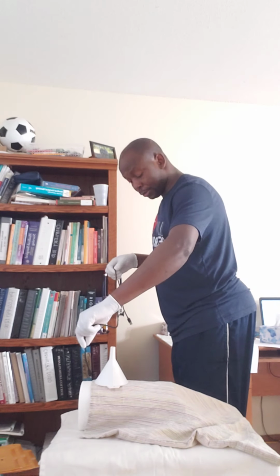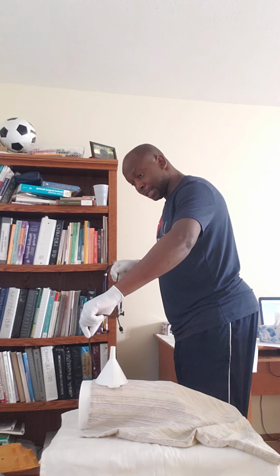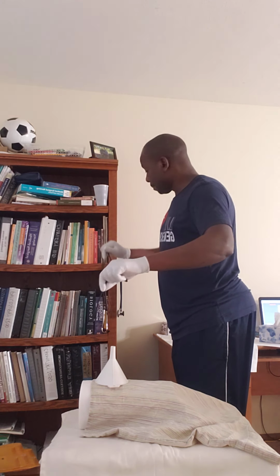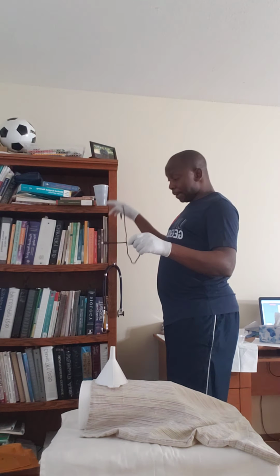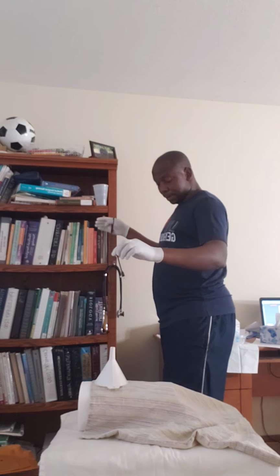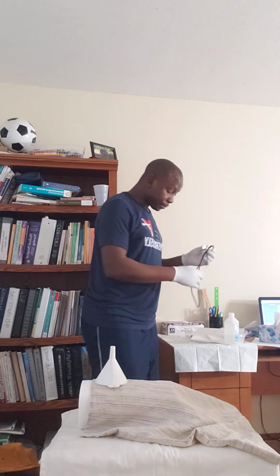So I'll put it to the patient, then I'll suction. When I'm removing it, I'm suctioning for 10 to 15 seconds. The secretions are sucked through this tube and come over here. Then in 15 seconds, I'll put everything away.